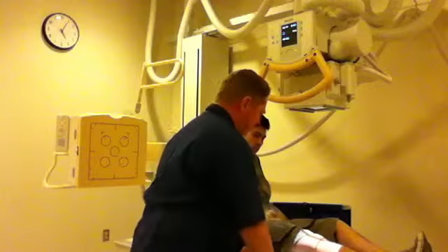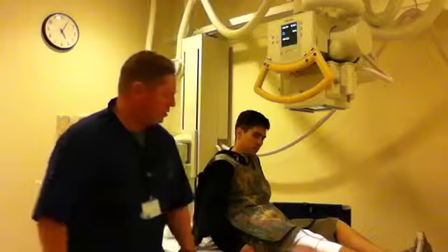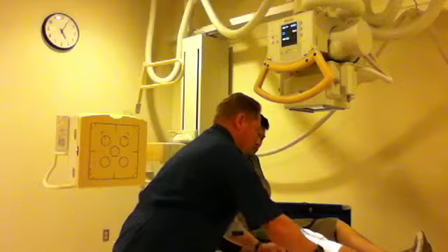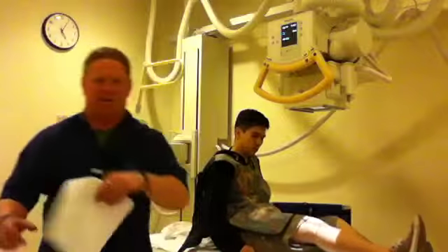Do the same technique. Have him stay still. Shoot. Come back in. Lift up. Take this, stick it in the reader.